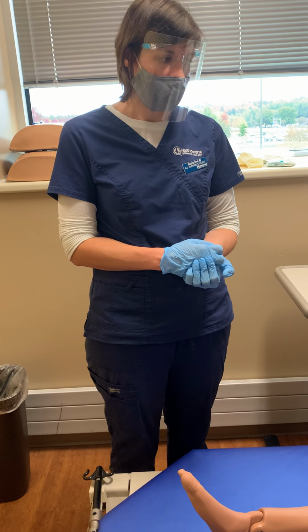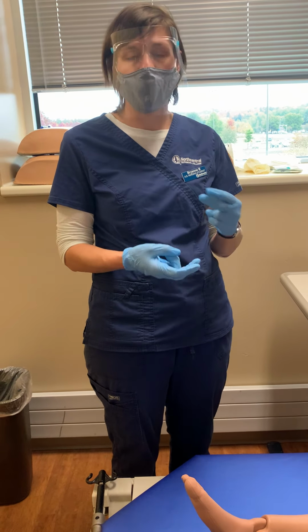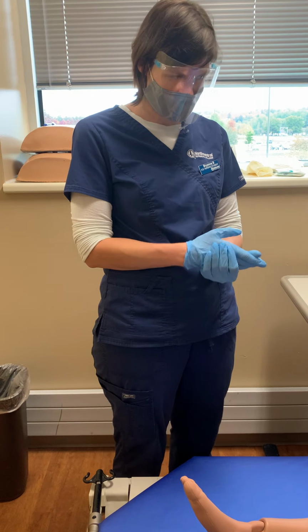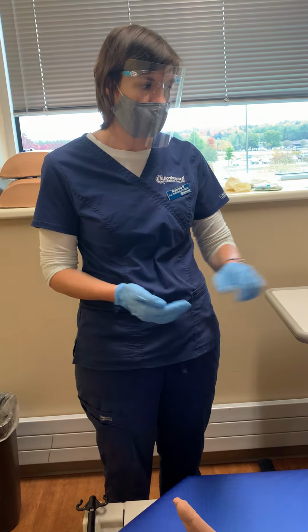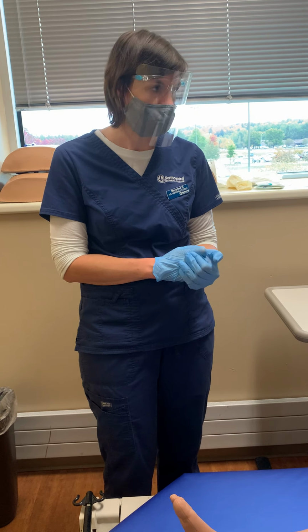And I would document my central line dressing change as well. Notating, I would do REEDA. When I was changing it, I was looking for any redness, any ecchymosis, any drainage. Not much for approximation there. I would also have looked at my dressing when I pulled it off, making sure that there was no drainage on there. If there was, I'd be checking color, odor, consistency, and amount. I would have documented if there were any issues, but I did not see any. I document where my new length from insertion to hub is, as well as my circumference of the arm, so that next time it was changed, we could compare against those numbers again.